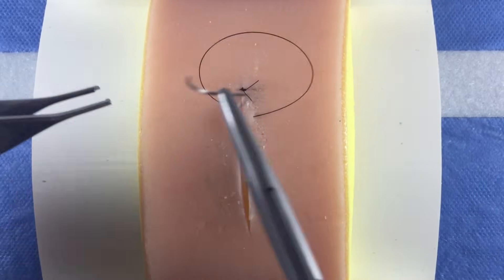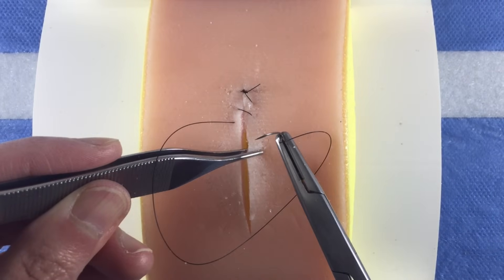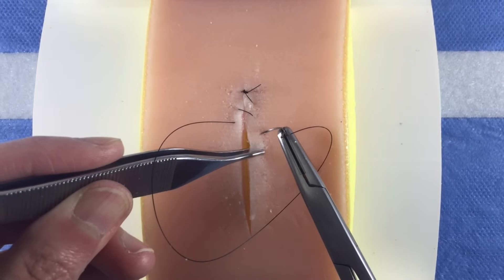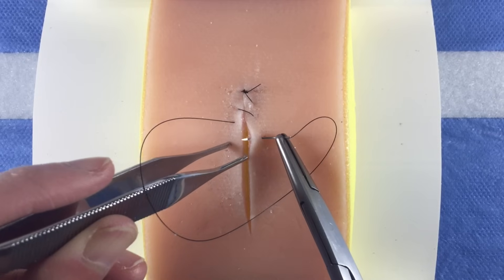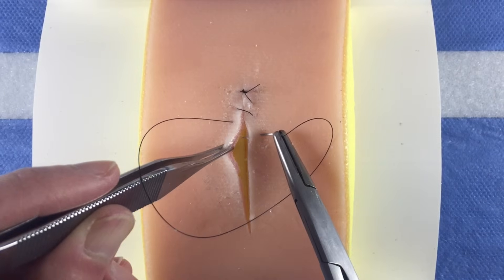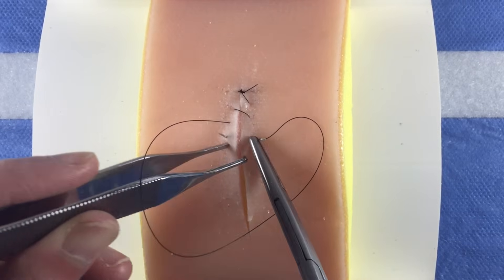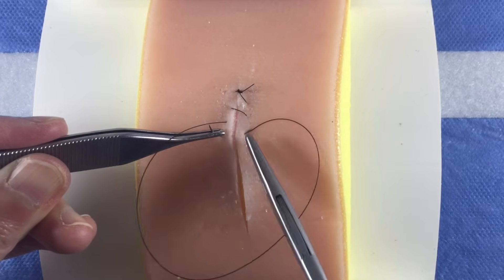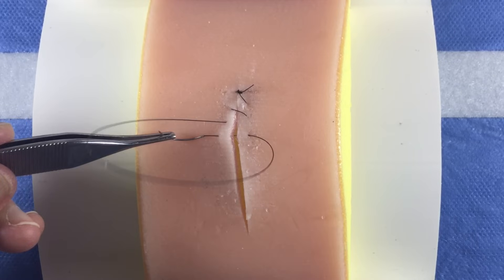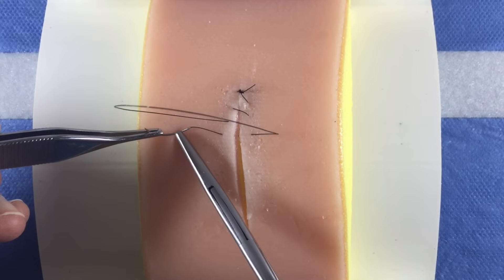You should be able to drive the needle across in one bite. First, cock your wrist back so that the needle is perpendicular to the surface of the skin. As the needle penetrates the skin, turn your wrist and let the curve of the needle do the work. Direct the tip of the needle to where you would like it to exit on the opposite side. Grasp the needle with a forcep and reload the needle on your needle driver so it is ready for the next bite.